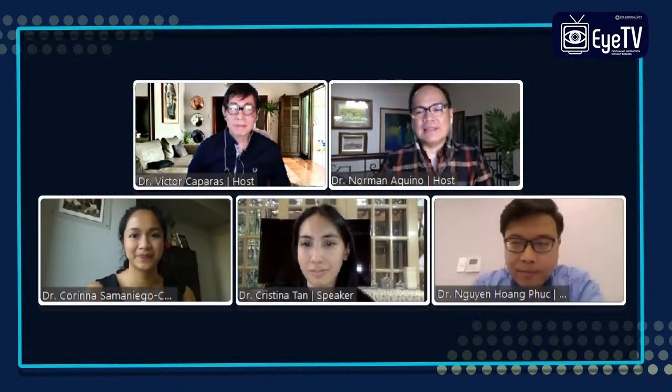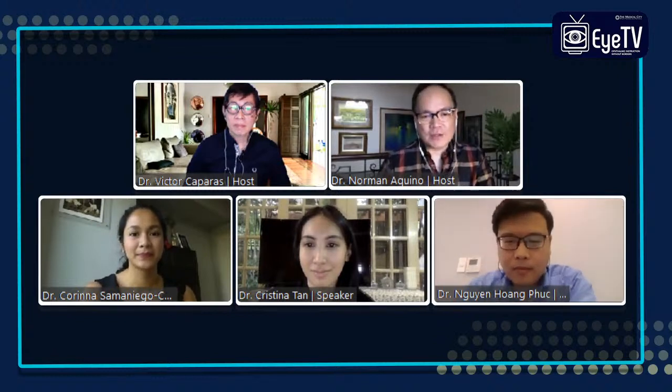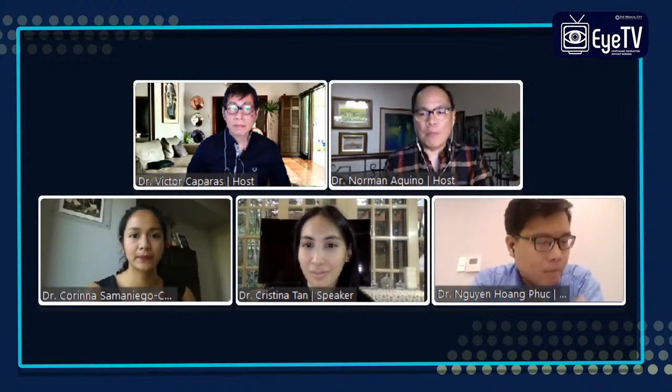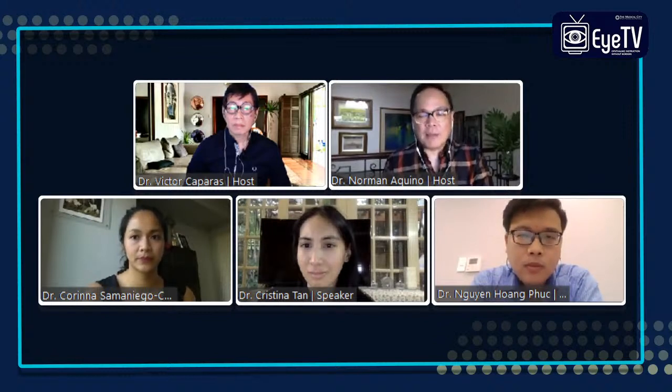Thank you, Professor Nguyen. You certainly opened our eyes as far as the interrelationship between corneal characteristics and IOP measurements are so much in close connection with each other. You know that as a glaucoma specialist, our world revolves around intraocular pressure, and we have always been trying to look for a way as to how best we can measure it. I mean, in the truest sense, the only way to measure true intraocular pressure is by sticking in a manometer into the anterior chamber of the eye. But we all know that that is not practical.